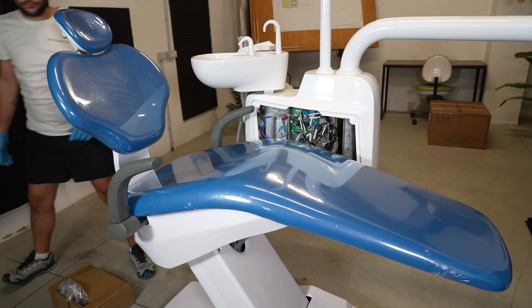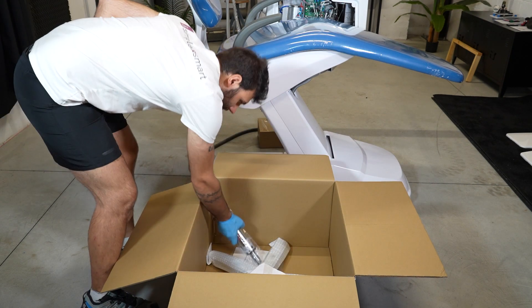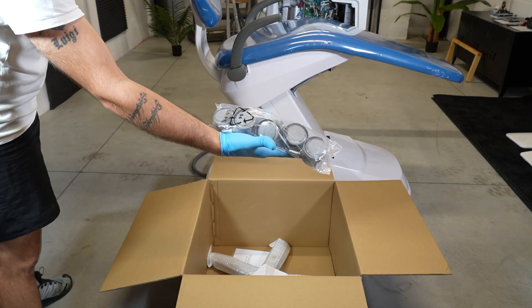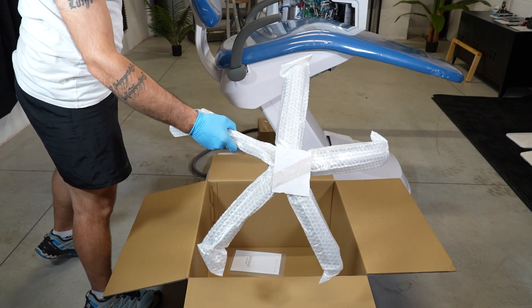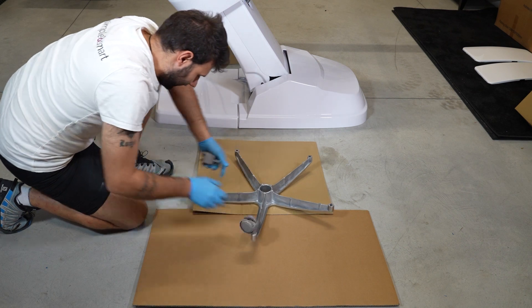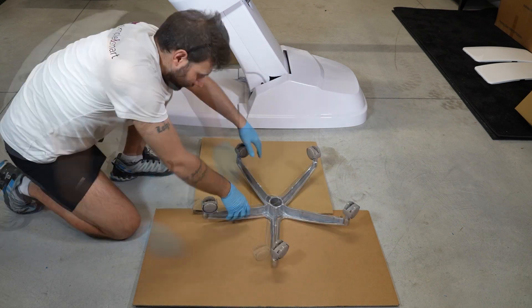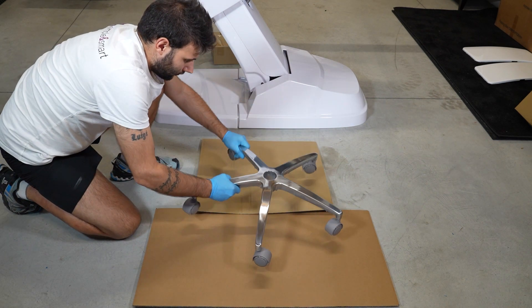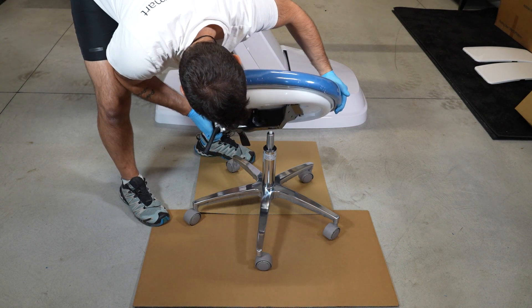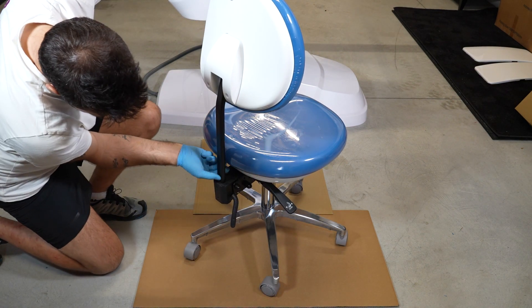In the stool box there are the backrest, the seat, the piston, the wheels, and the base structure. Place the five wheels on the stool base structure. Place the piston and then the seat. Put the backrest on its support and fix it by closing the knob rear.